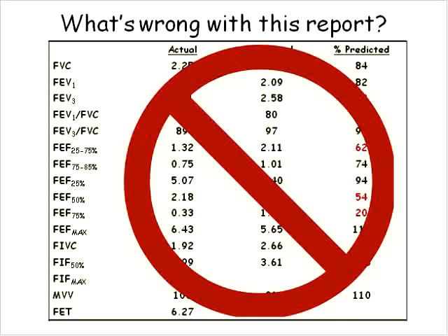So this is a good example of a bad report, if you will, and of things that we might want to avoid if we're going to keep the report as simple as possible.